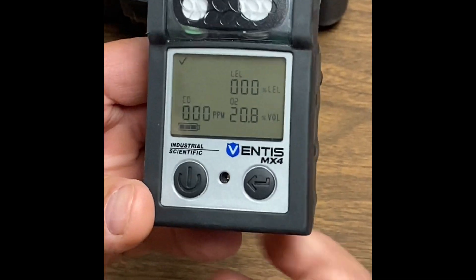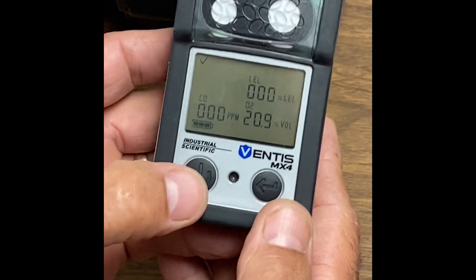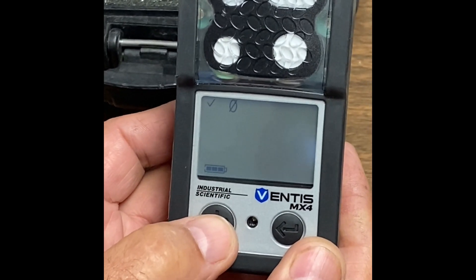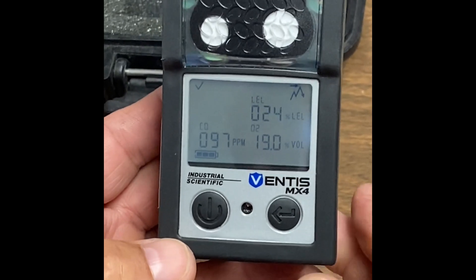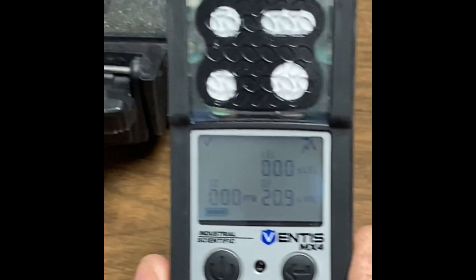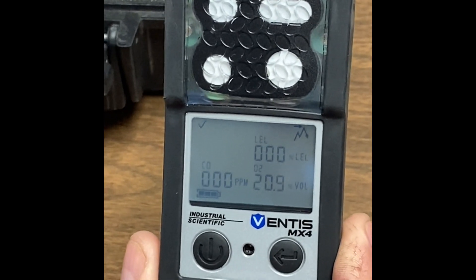If you wanted to clear your peaks for whatever reason, you utilize your mode button — one, two times, three times, four times — and you'll see the little peak in that upper right-hand corner. You can just hit your enter button, and that clears your peaks.